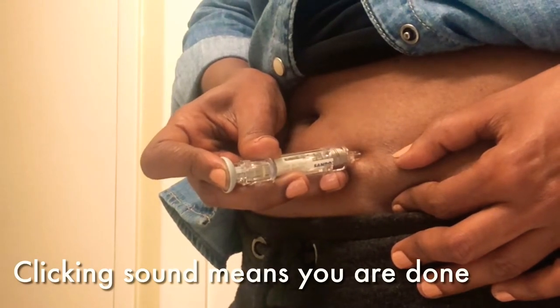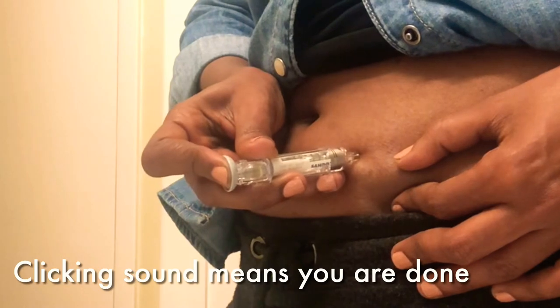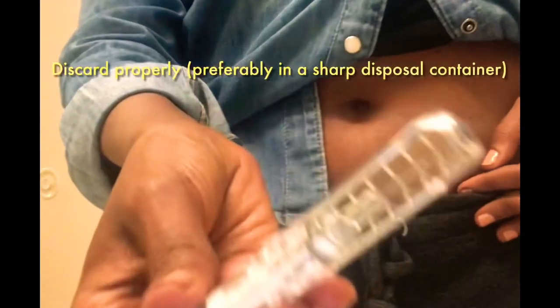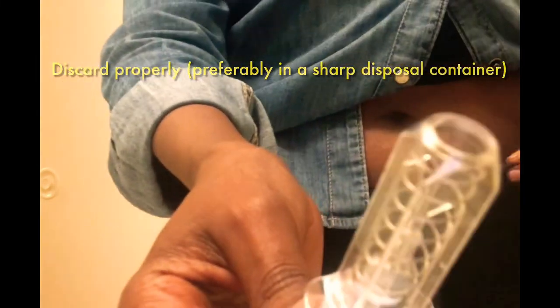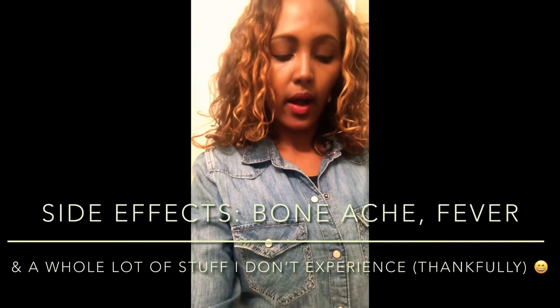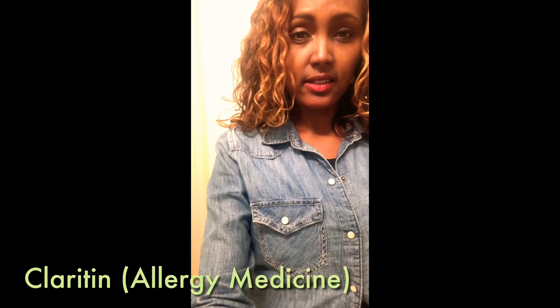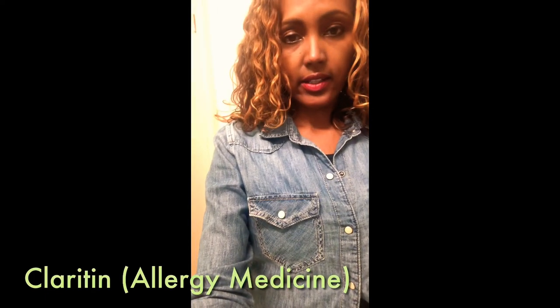I feel the click, and when I let go, you can see it's out — the little needle goes back inside. It gives bone ache, so they suggest you just buy Claritin, which is an allergy medicine. Just take Claritin because it helps a little bit.